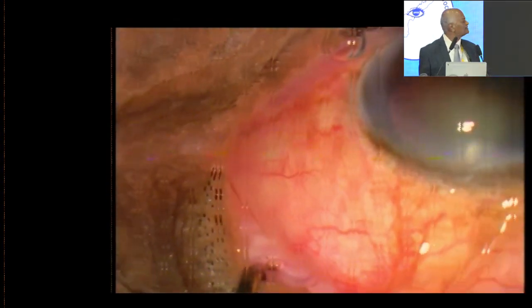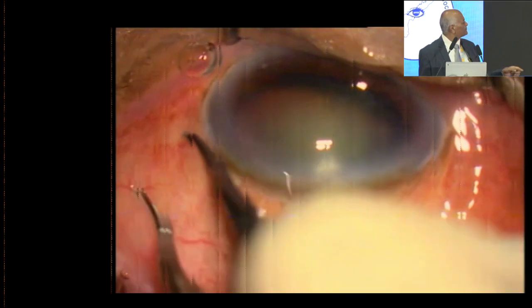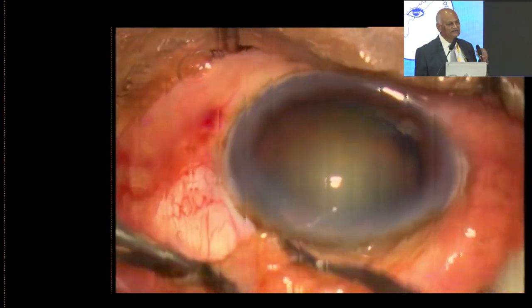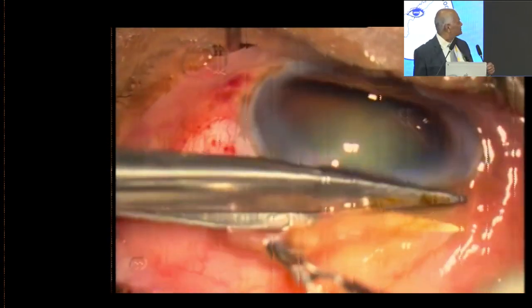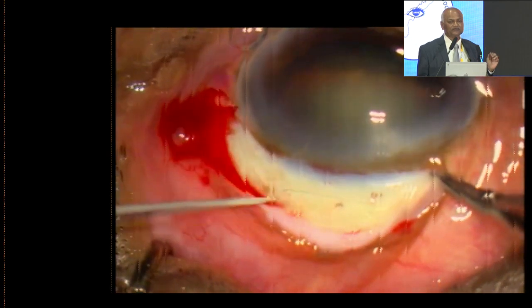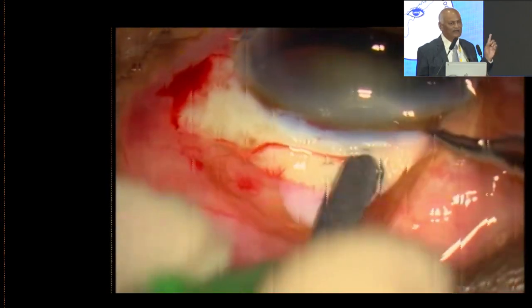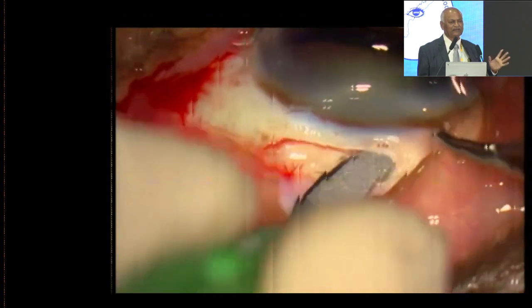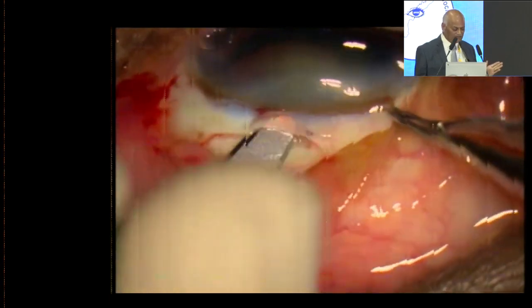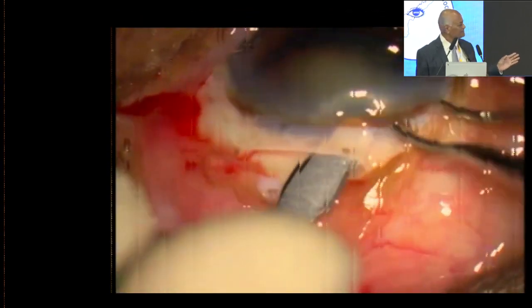Now, here you will see again what I am doing. Whenever you are doing any surgery, see here, this is Dr. Agini, who is a left-handed surgeon. Whenever we are doing the surgery here, always remember that the conjunctiva, we will have to repose the conjunctiva. So, instead of making a very small conjunctival flap, you can make a large conjunctival flap and repose that. If you repose it, from the second day the patient will not feel any foreign body sensation or watering. So, the conjunctiva is also equally important whenever you are doing phacoemulsification or SICS.